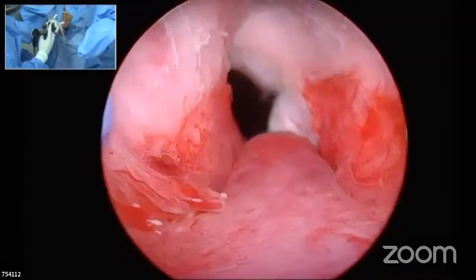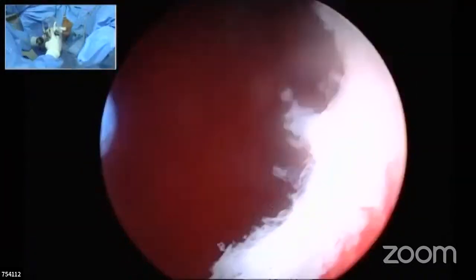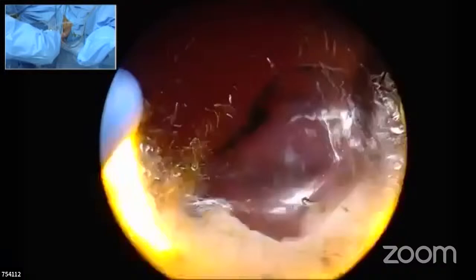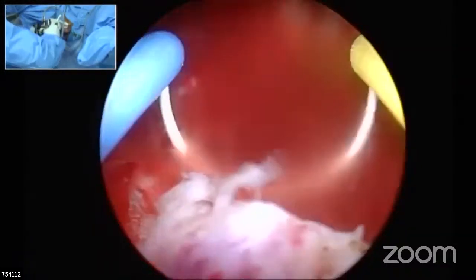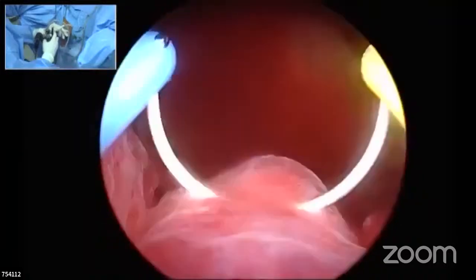So if I look at now, this is the verumontanum. I have a fair amount of the tissue which is there. The excess amount of flap which is created, because I wanted to preserve as much as possible, is not necessary. It is too thin. It doesn't serve any purpose. So I'm trimming that flap, but not to an extent of compromising my length of the thing. So having done that, this is the veru.